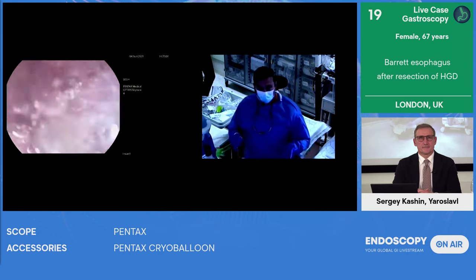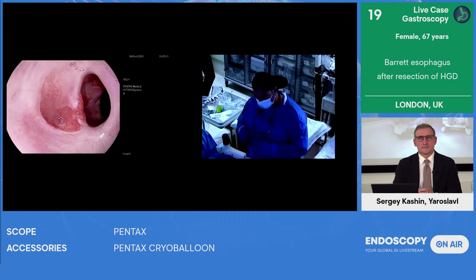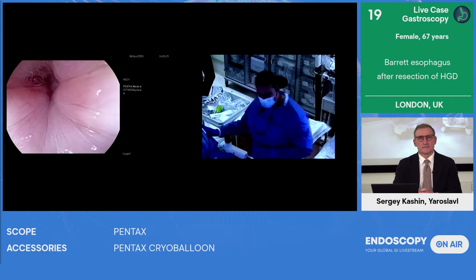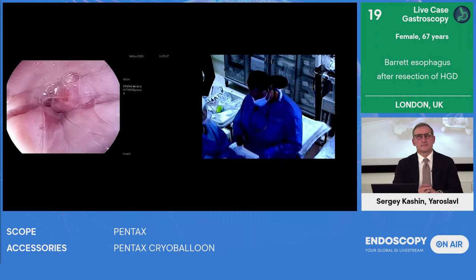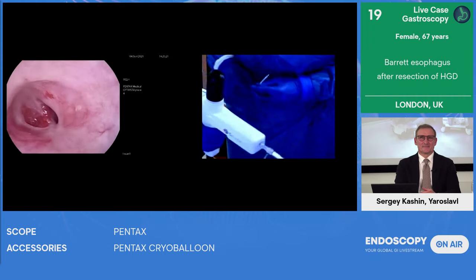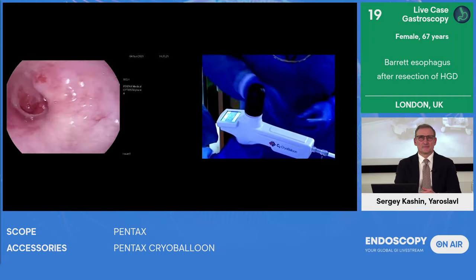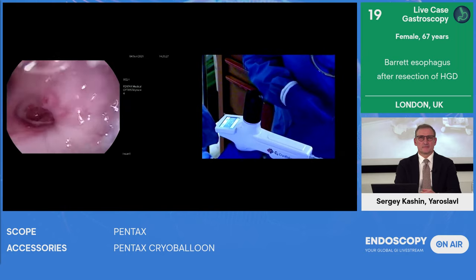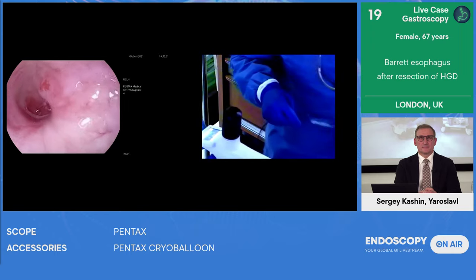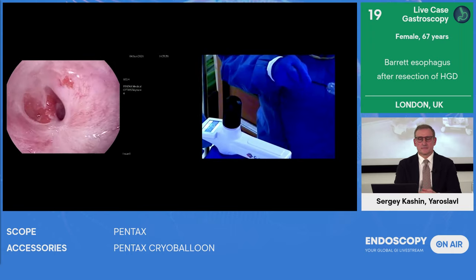So this is the device that we use for cryo balloons. We're very privileged, we're still the only site in the UK doing this. This is Trixie, my fantastic assistant, who's holding a second generation controller here. This has had a software update, and what you can't see is it's all automated. There's a digital supply here. And there are two different types of catheter for cryo balloon. There's this catheter here, which I'm just going to blow up now, which is a straight catheter. It's 10 centimeters long.